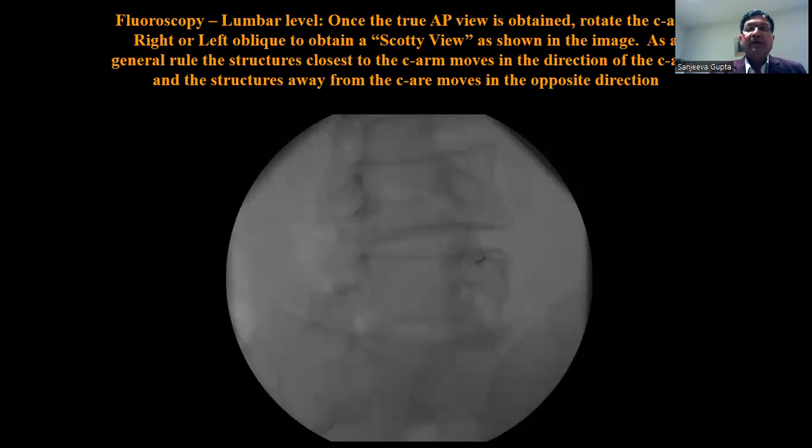Once the true AP view is obtained and the vertebral end plates have been squared off by either a cephalic or a caudal tilt, then go right or left oblique to get a Scotty image. Obtaining these images, you can do almost all the procedures at the lumbar spine level. So true AP view, then square the vertebral end plates closer to the target, and then go either right or left oblique rotation. Here, I've gone right oblique rotation, and you can see a Scotty view has appeared.